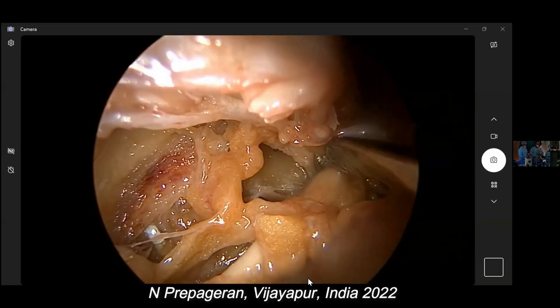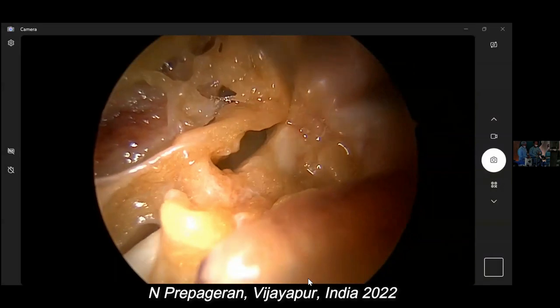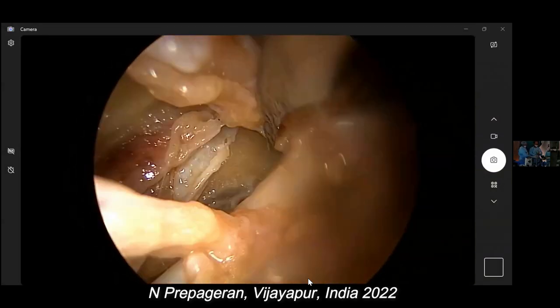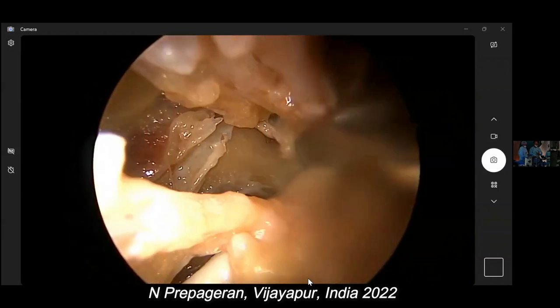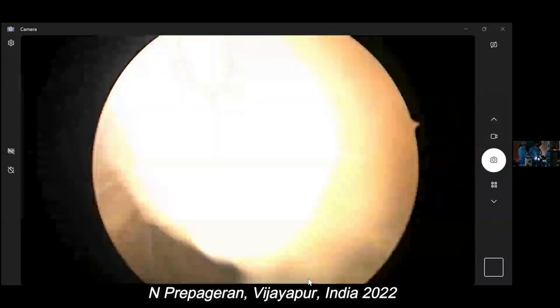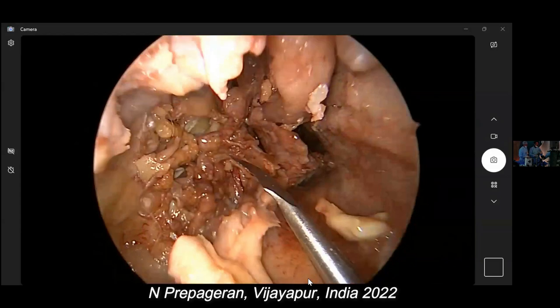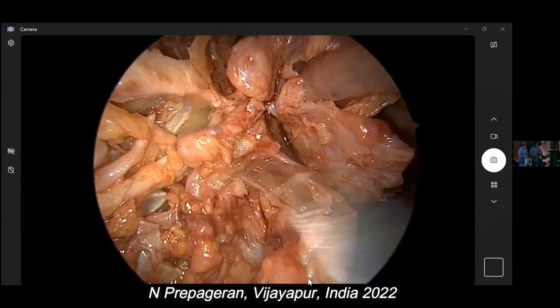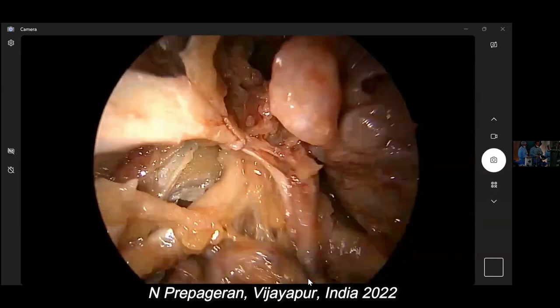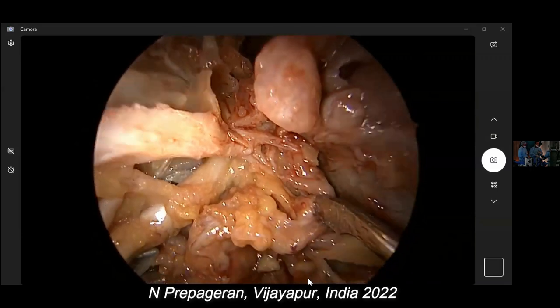That's your foramen rotundum, up here. I cut this a little bit more. There. Can you see? That's your foramen rotundum. Can you guys see that? Clear, guys? So now, let me dissect a little bit more here. And you can see the branches. Can you see this one?